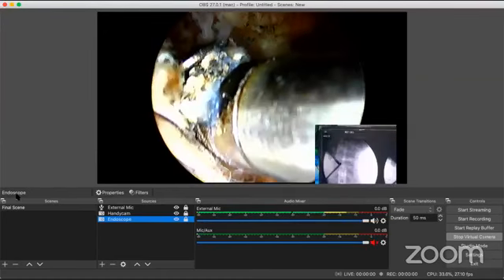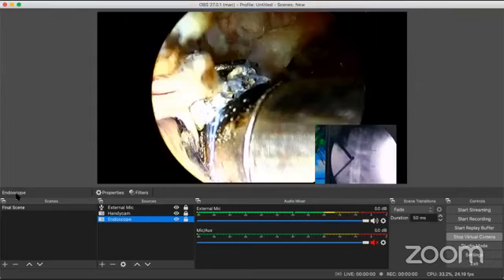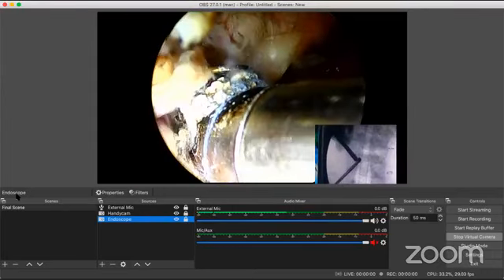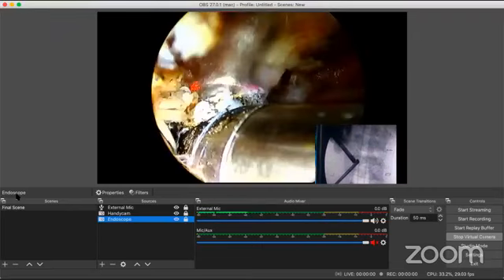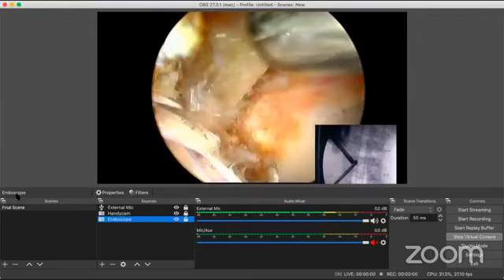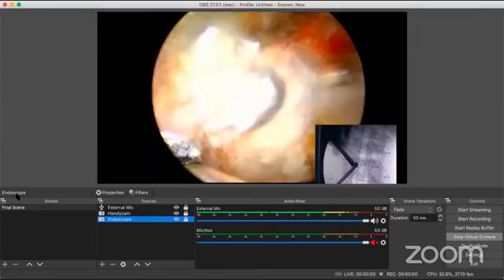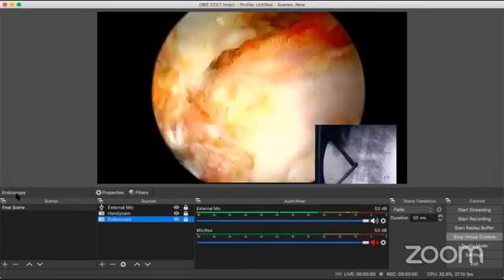Both the instruments are now on the upper lamina. You followed? So I have identified the upper lamina. Can you fire yellow, please? Now, this is a wonderful thing about the Endovision plasma because it allows me to really strip away tissue in a very beautiful, gentle manner.